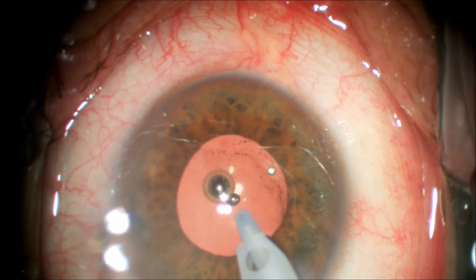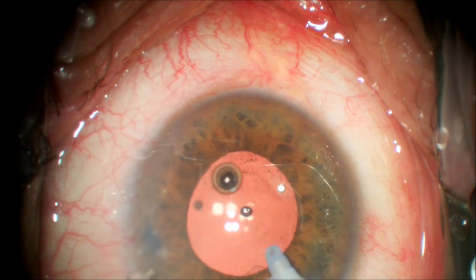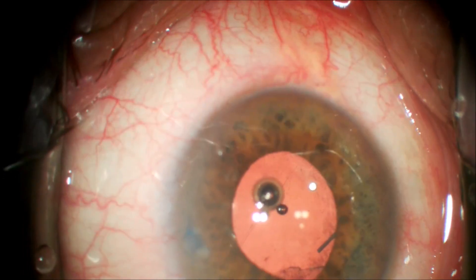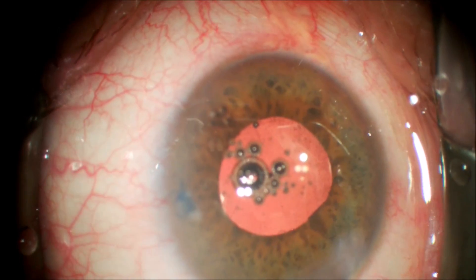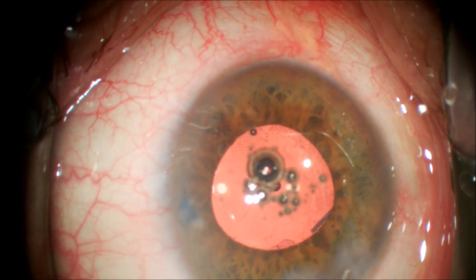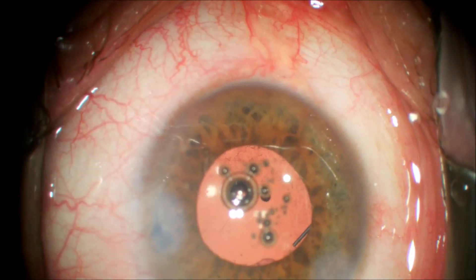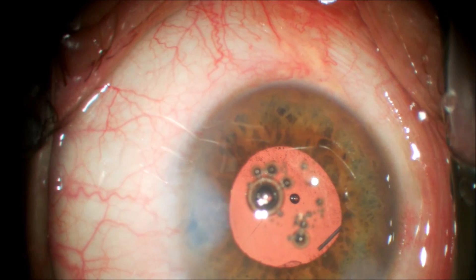We will now stromally hydrate the wound. We take care as we remove the irrigation-aspiration handpiece to keep the anterior chamber full by injecting BSS through the side port incision, so there is not a collapse of the capsular bag. We stromally hydrate the clear corneal wound with the 27-gauge cannula as well as the side port incision — this will provide a good seal that should be leak free. We check the intraocular pressure and fill with some balanced salt solution. And this completes the case. Thank you for your attention.